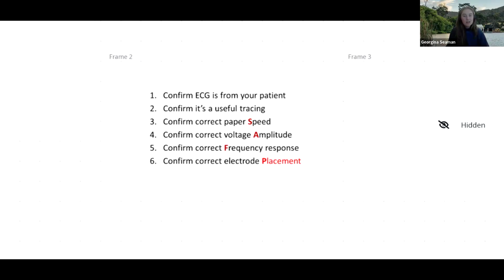All right. So in general, in most pre-hospital settings, we either have 0.05 to 150 hertz or 0.05 to 40 hertz. But what is the rationale behind that, as Anita has said? Anita, do you know much about the reason that they changed the hertz?